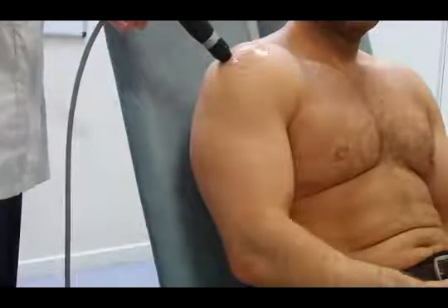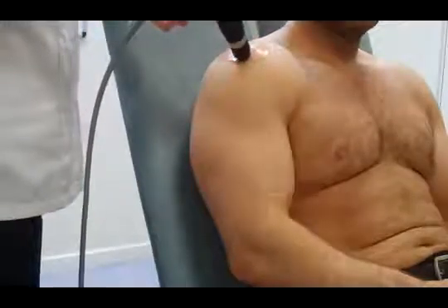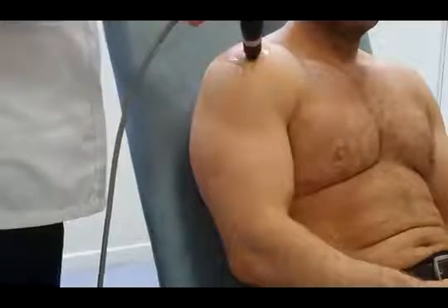It's quite important when you're doing the shoulder that the patient doesn't do too many impact loading activities, either during or immediately after the treatment. I say for 4 weeks after the treatment.